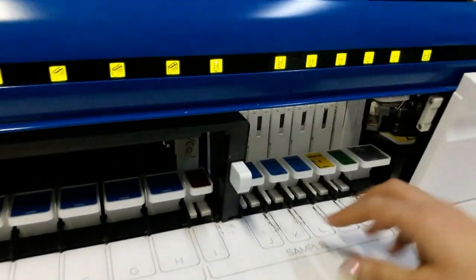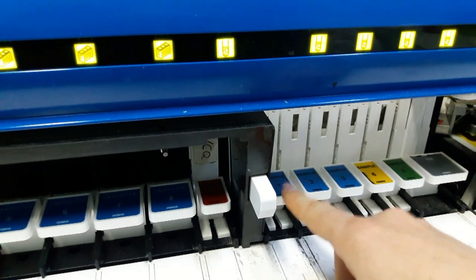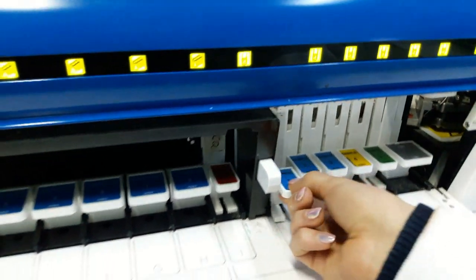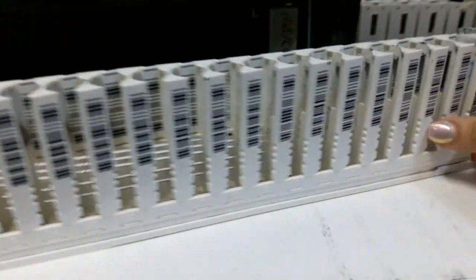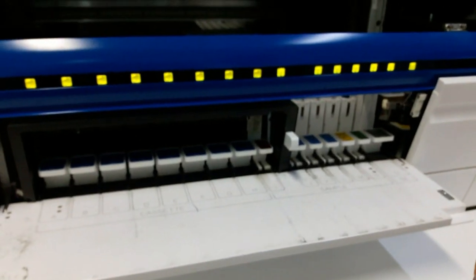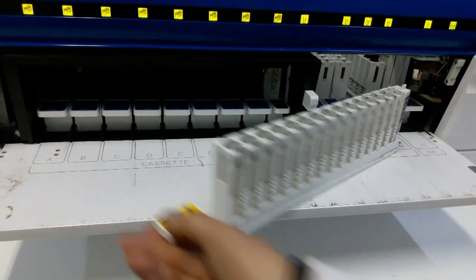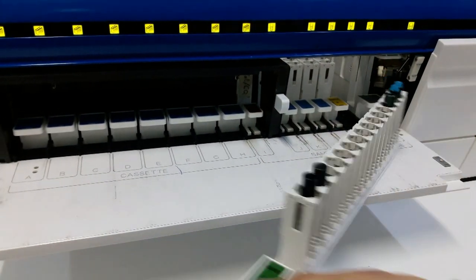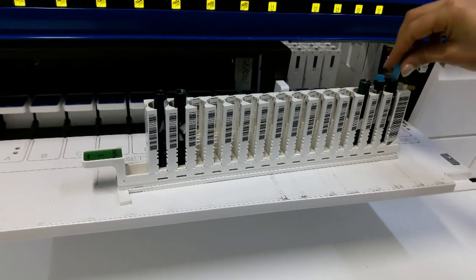Cette zone-là est consacrée pour les analyses des échantillons. Il y a deux types d'échantillons : les échantillons plasmatiques et les échantillons urinaires. Pour les échantillons plasmatiques, il existe trois racks bleus. Le rack jaune est celui des urines, c'est le rack 4. Et le rack 5, vert, est celui des quantités insuffisantes. Il suffit de prendre le sérum et de décompter dans cette petite cupule bleue.